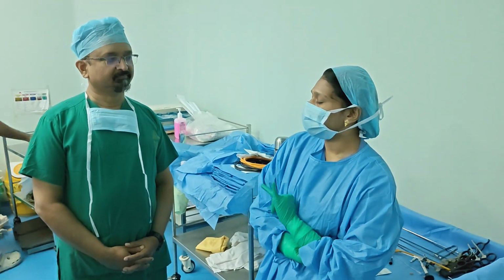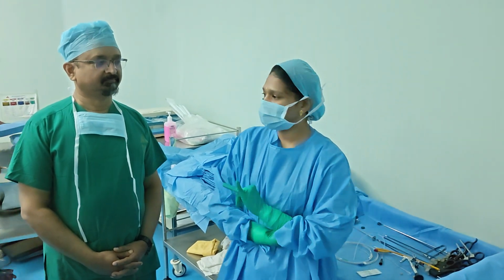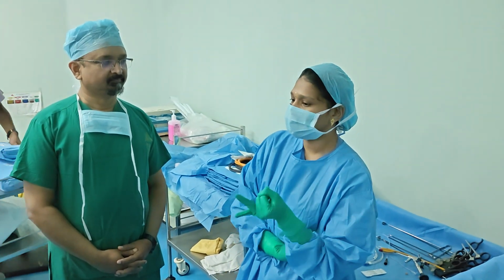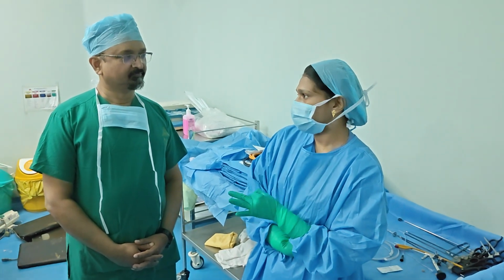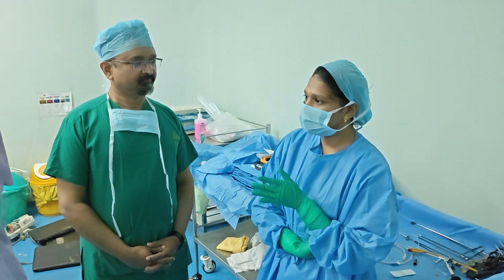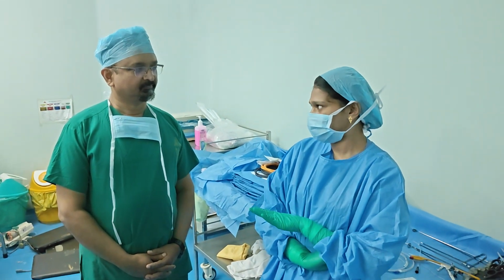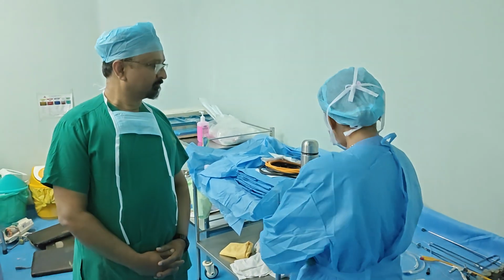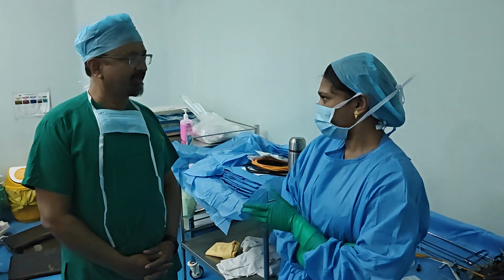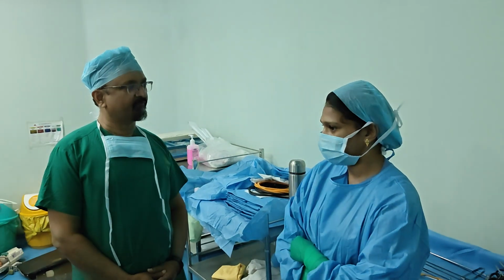Then depending upon the age of the patient, we have to prepare the stent sizes. If it is below 5, a 3 French 12 or 3 French 10 stent is enough. If it is above 5 years, we prepare 4 French 16 or 4 French 18 stents. And then the availability of the monitor, and whether the surgeon needs recording facilities.